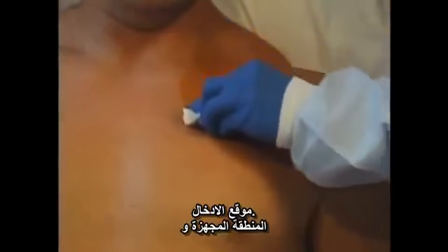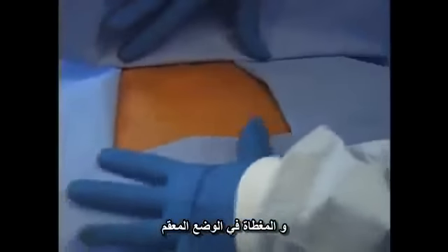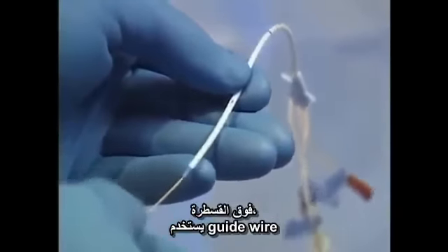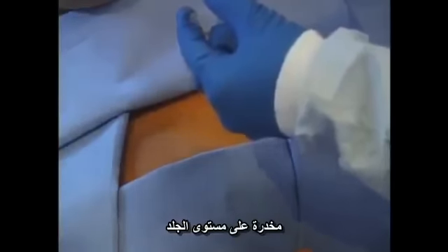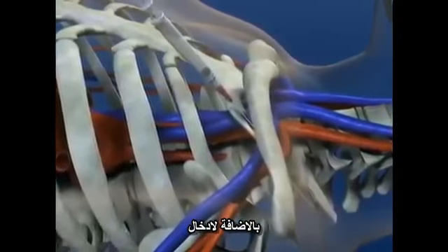After noting the insertion landmarks, the area is prepped and draped in sterile fashion. The modified Seldinger technique, threading the catheter over a guide wire, is used in almost all central venous catheter insertions. Again noting the insertion landmarks, the area of insertion is anesthetized at the skin level, and if possible, the deep subcutaneous area and the periosteum of the clavicle are anesthetized as well.